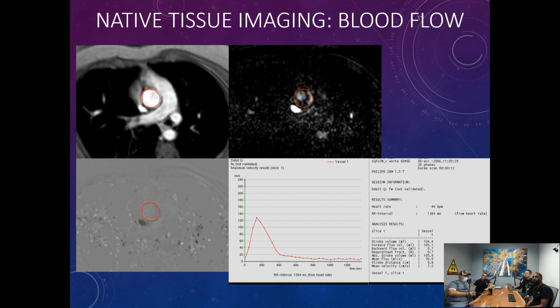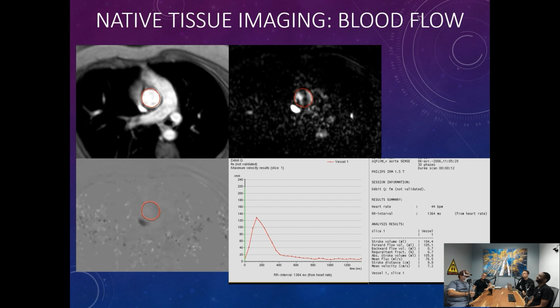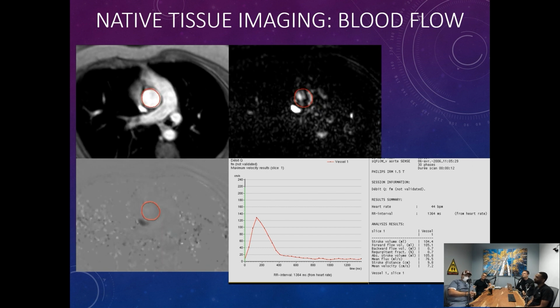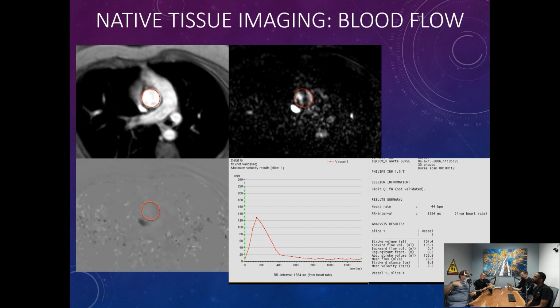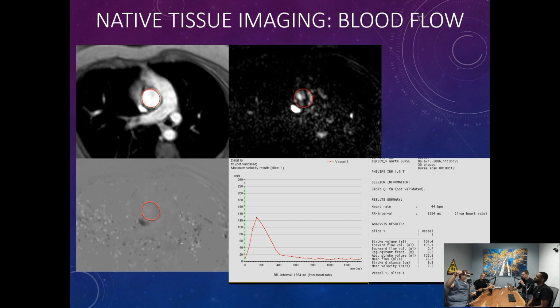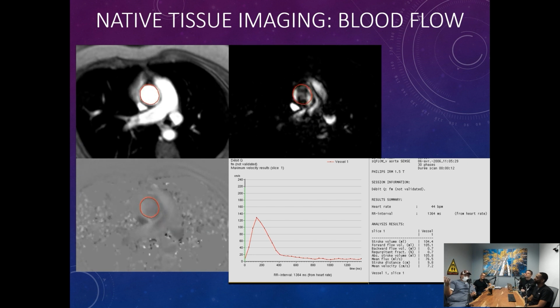The post-processing is immensely time-consuming. It requires very powerful computers and very powerful programs. So 4D flow is just now coming on the scene. It's going to be great because it's very much like CT in that you get a data set that you can slice and dice retrospectively. We can dial in on the tightest spot and make sure we're at 90 degrees so there's no gap anymore. But the problem is these sequences take a long time.